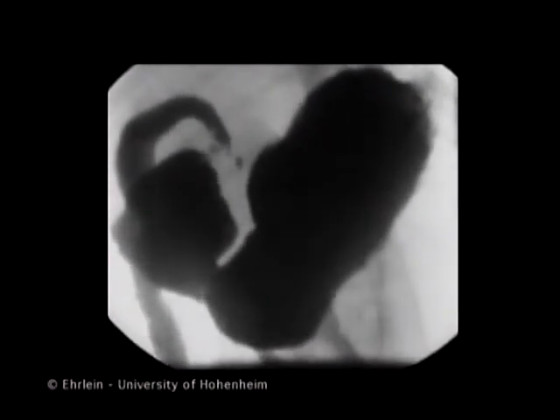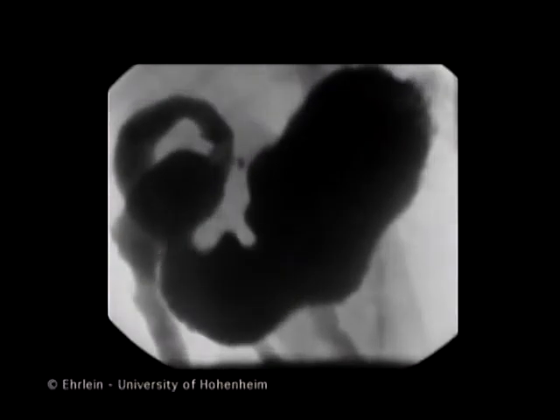These three cyclically recurring phases represent the antral pump: propulsion, emptying, retropulsion. The three phases can be observed several times.